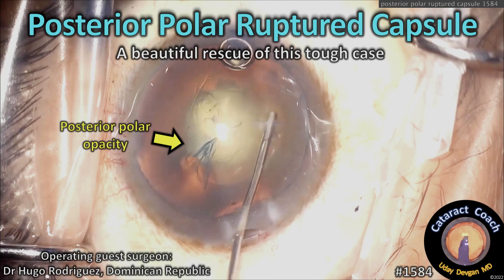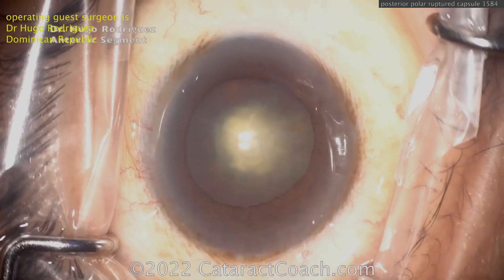CataractCoach.com — posterior polar cataract with a ruptured capsule. We have a beautiful rescue of this tough case. Let me show it to you.